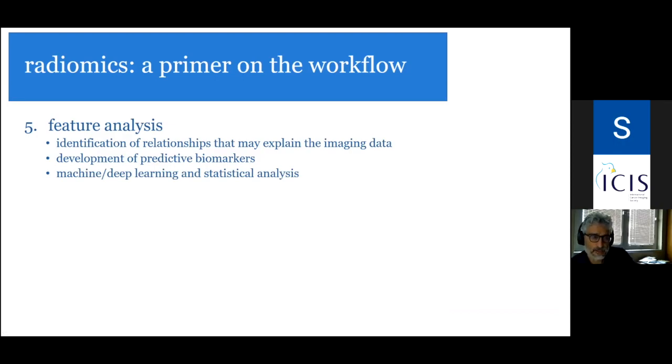The fifth and final step is feature analysis. Again, this is done by software which tries to identify the relationships that may explain imaging data and develop, consequently, predictive biomarkers. This is done by machine and deep learning algorithms, and may be done also with statistical analysis.